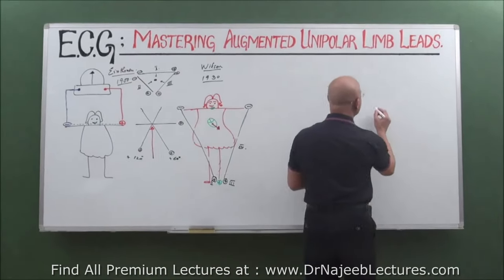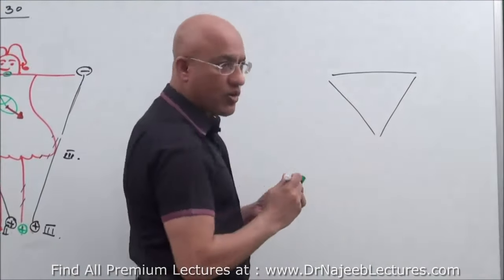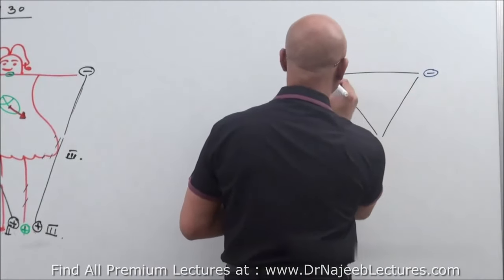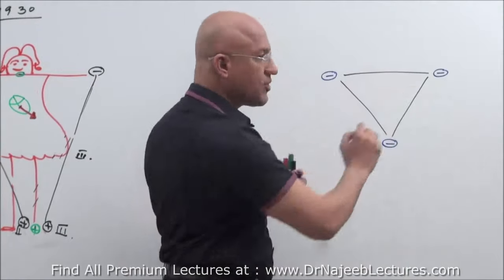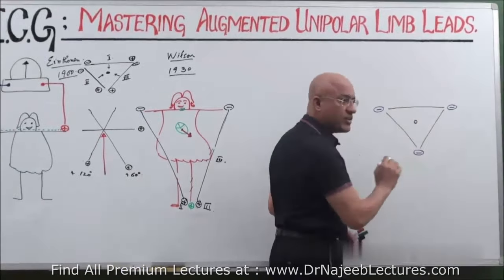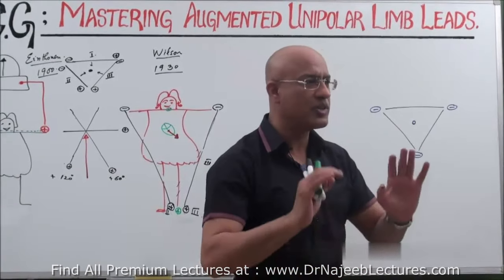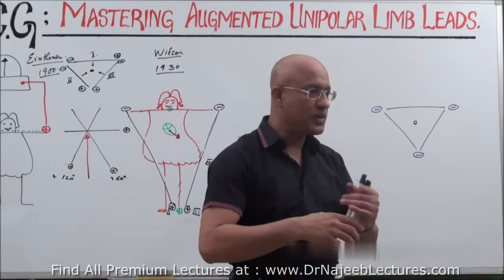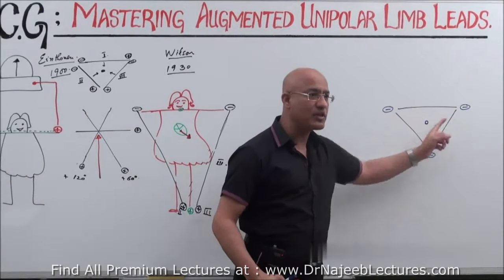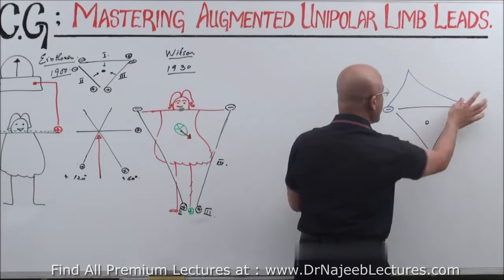Idea is this: if you make a triangle, and triangle is equilateral. Equilateral means the sides of the triangle are same length. And if you put same charge at the three apices of the triangle, the sum of these charges in the center will be zero, because all these charges will cancel each other. If you have passed your geometry with flying colors, you must know it. Otherwise, you just trust Wilson was right, that if we have an equilateral triangle and put negative electrode at every corner, and all these three electrodes, listen now carefully, are connected to each other. Okay, I will make color of this different.